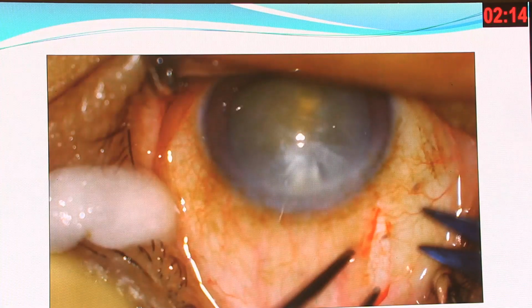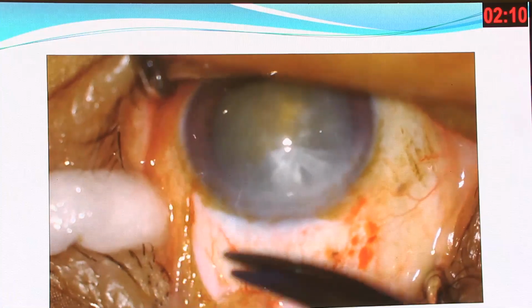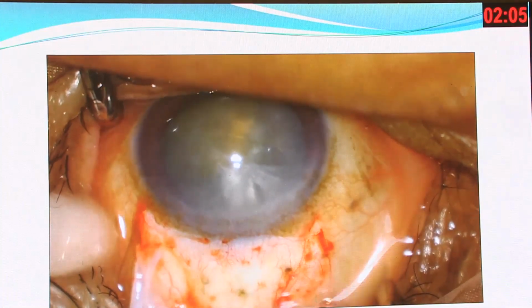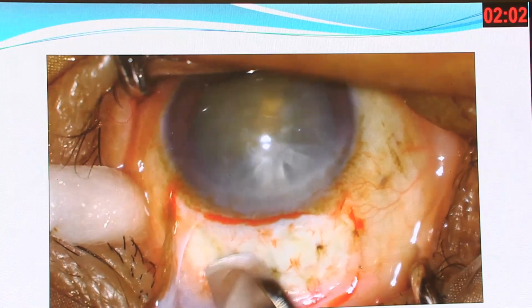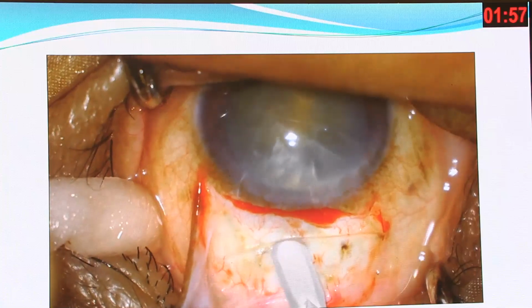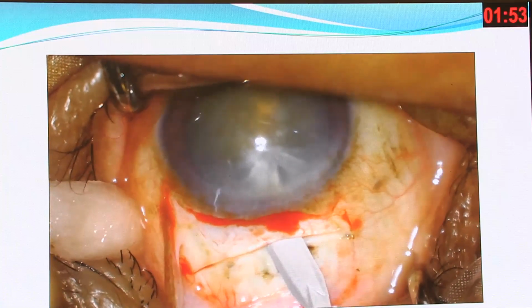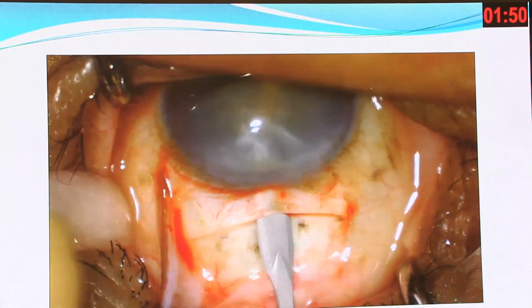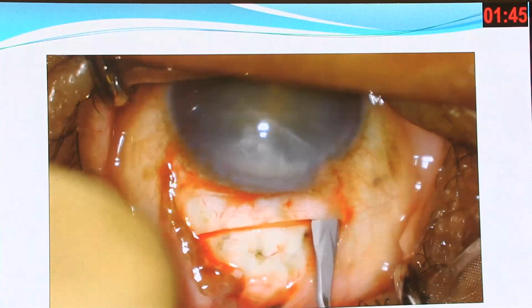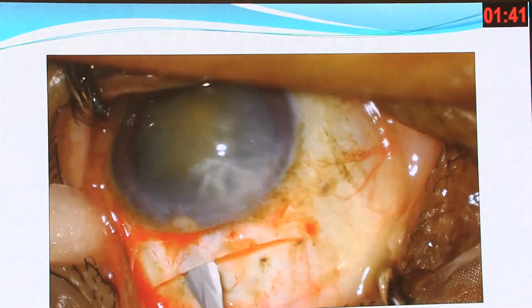Now a small video. Make a conjunctival incision. Cautery is done, and a frown incision is made with the Bard-Parker knife. The dissection is made first in the sclera by a sweeping movement, first at the front and then on the sides, slowly, on both sides.